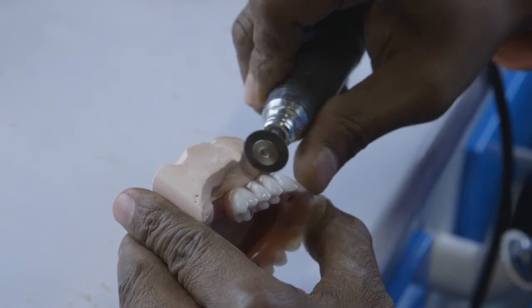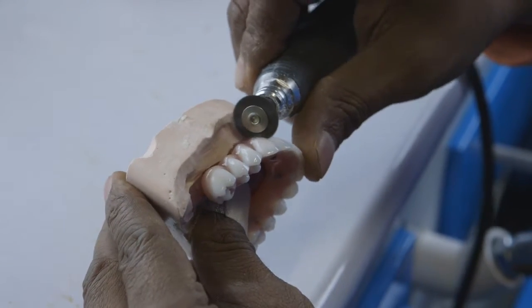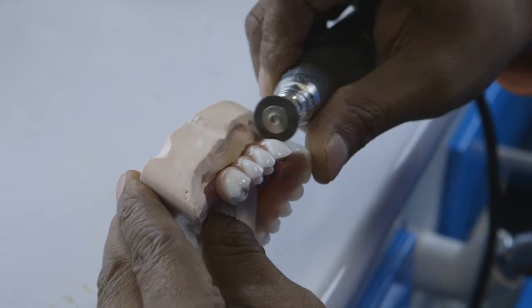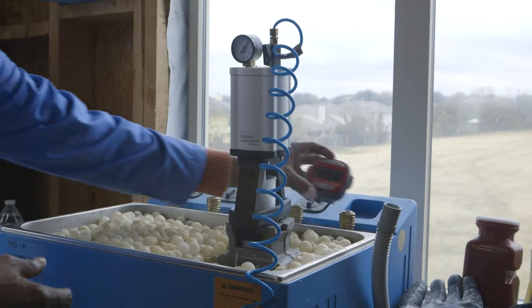My technician and I can communicate the changes or the improvements that the patients request, and those are made real-time — immediately. The patient doesn't have to wait, and they can preview those changes before the denture is processed.